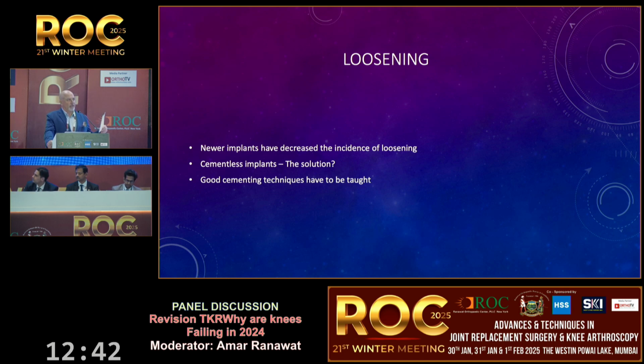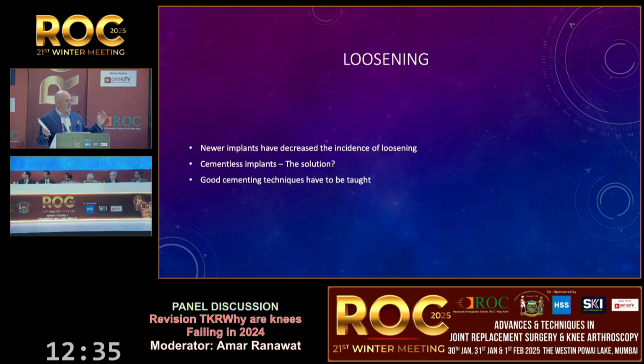I think everything in life is a process. When you put a cementless hip in, you don't have perfect contact all the time. You just want the trial to be stable, right? And then you put the implant in and it's stable and it works. The same thing happens in a cementless knee. The bone cuts don't have to be perfect, but as long as it's stable when you put it on, you get comfortable.